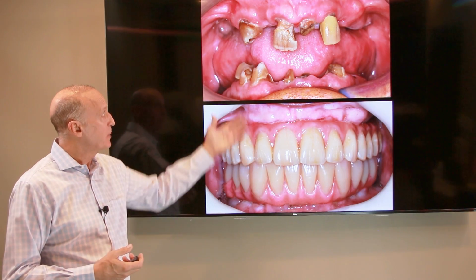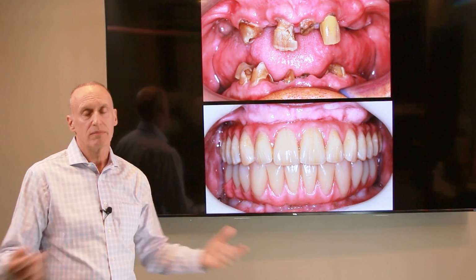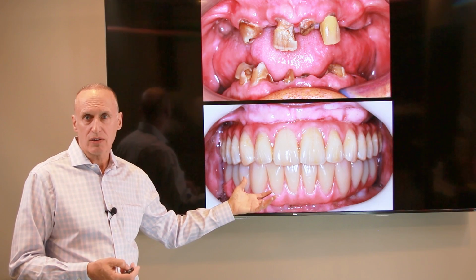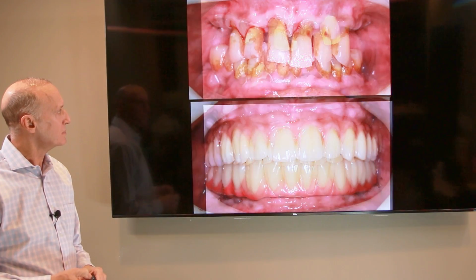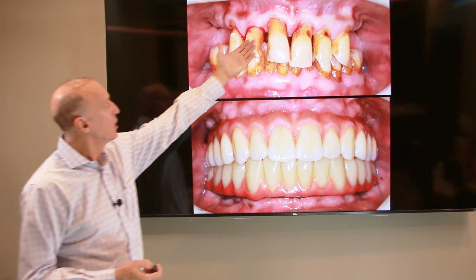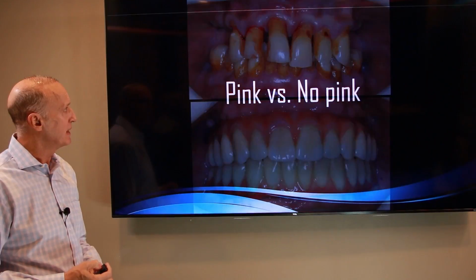Every once in a while, we get an 80-year-old patient that wants teeth that are age appropriate. And just know that we can do that. They don't have to be this characterized, but that's what he wanted. And I'm really proud of my lab for being able to do that. And another. So notice how much bone loss here. We're going to talk about this patient in just a minute.